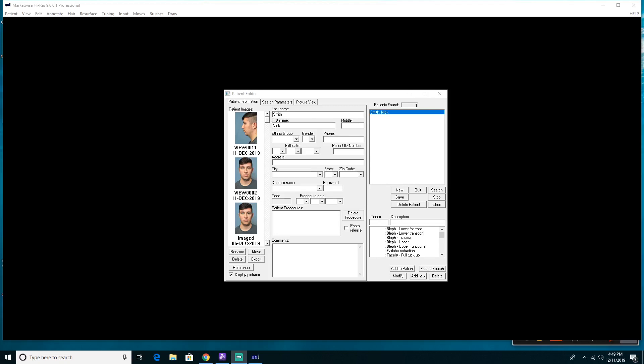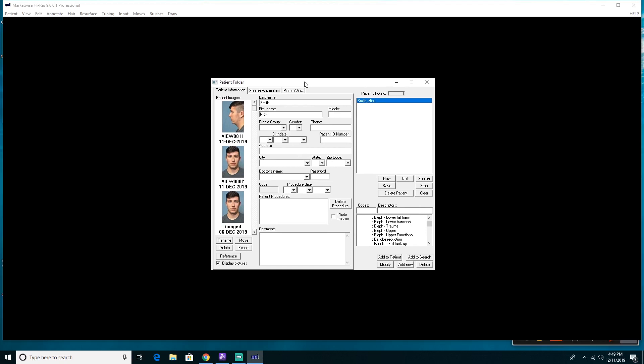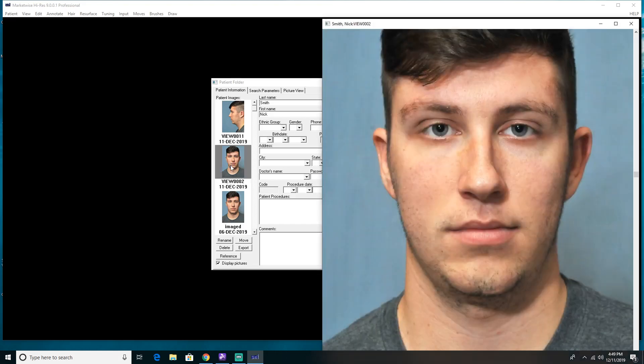How to image a rhinoplasty. We have our patient chart open here for the young man we're going to do a rhinoplasty on. I'm going to double click his front view and here is our young man.